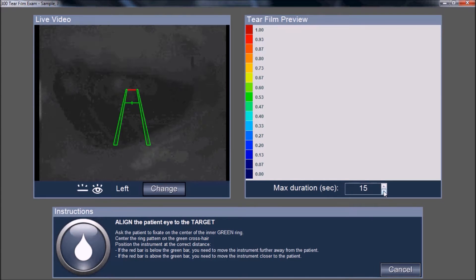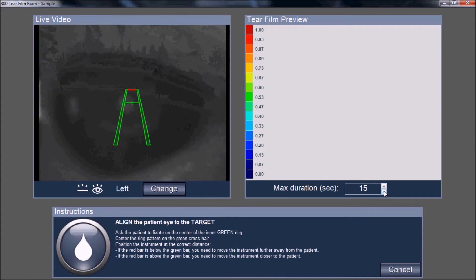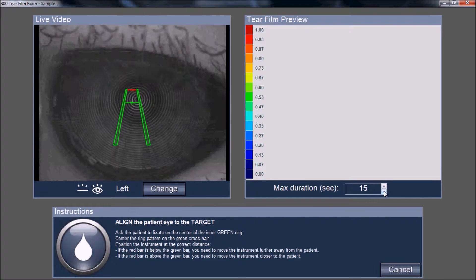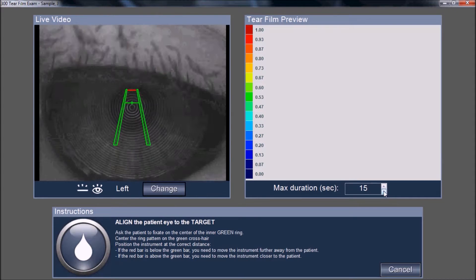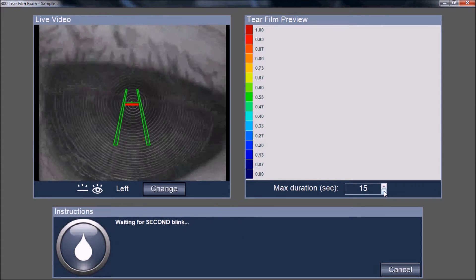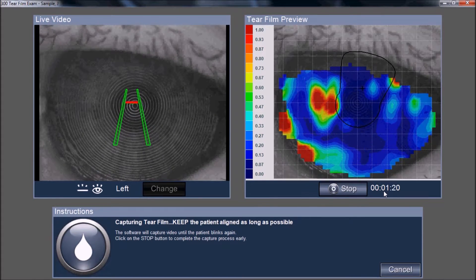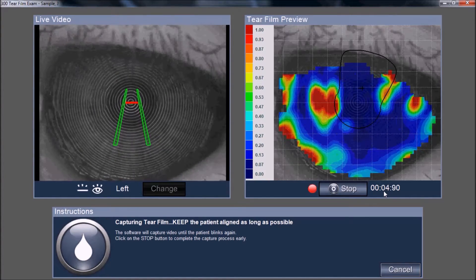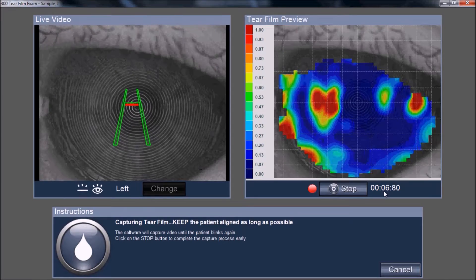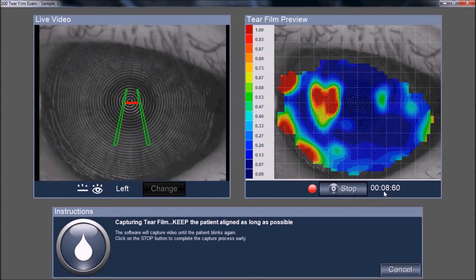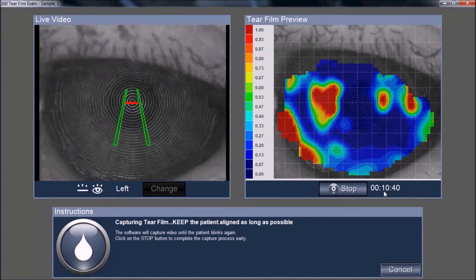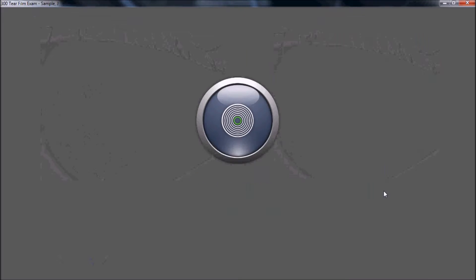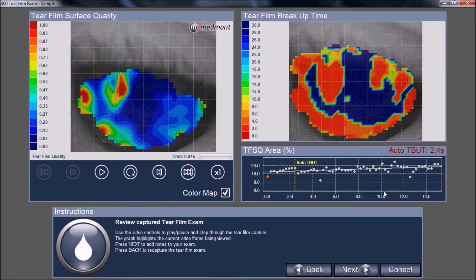Center the instrument, asking the patient to blink normally while centering up. Then ask the patient to blink twice and hold their eye open as long as possible. The video will automatically stop as soon as the patient needs to blink again, or when the 15-second duration is reached and the capture window closes. Try to keep the instrument centered throughout the capture.